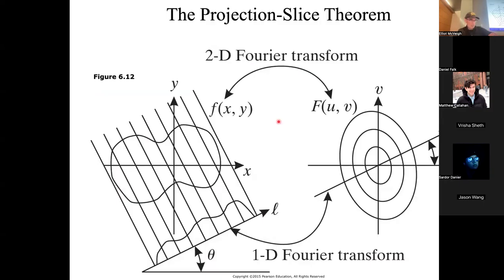Okay, so we're going to look at this really cool math that was derived by Radon. Do you remember we had those four people? There was Radon, EMI, Hounsfield, etc. They all worked out this math independently, but anyway, here we go. There's a really interesting thing that was proven called the projection slice theorem. It was proved mathematically at the beginning of the 20th century. We'll change our notation to the course notation, but in the book, I think this is how it is.